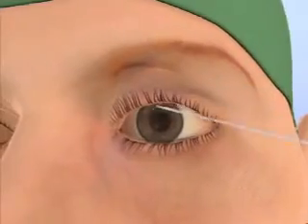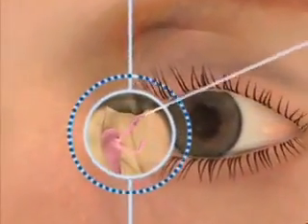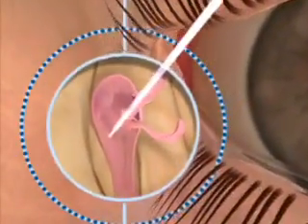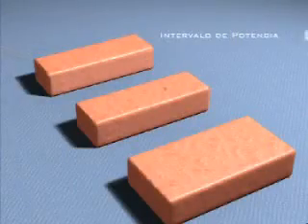Fibers of 600 microns allow us to overcome mucus or fibrous obstructions upstream from the lacrimal sac, and are easier to handle and position when delimiting the ideal area to create the new opening. The key to this technique consists in firing the laser pulse only after confirming the position of the laser fiber by transillumination through the bone with the nasal endoscope, thereby avoiding false pathways and iatrogenic lesions.